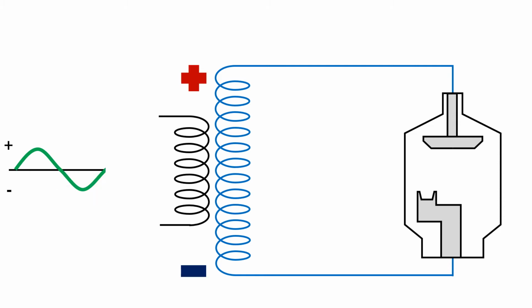Alternating currents flip the polarity of our step-up transformer. So during one half of the cycle, the polarity looks like this. Then on the other half of the cycle, polarity flips and looks like this. The top half of the graph indicates one half of the polarity cycle, and the bottom half indicates the other half of the polarity cycle. Every 1/120th of a second, the polarity flips, and so does the line graph.